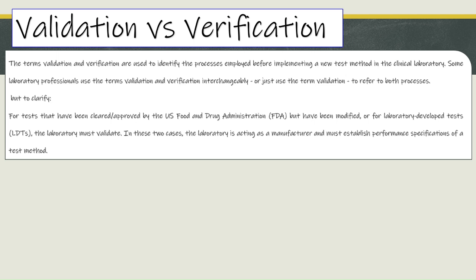For tests that have been cleared/approved by the U.S. Food and Drug Administration (FDA), but have been modified, or for laboratory-developed tests (LDTs), the laboratory must validate. In these two cases, the laboratory is acting as a manufacturer and must establish performance specifications of a test method.